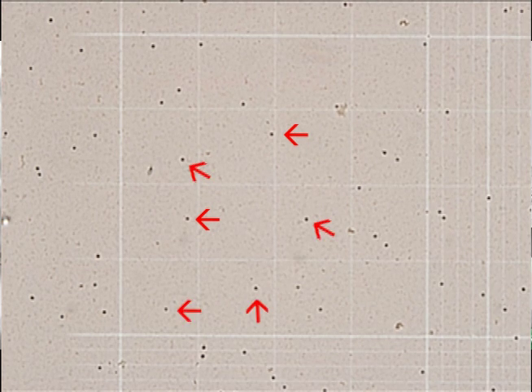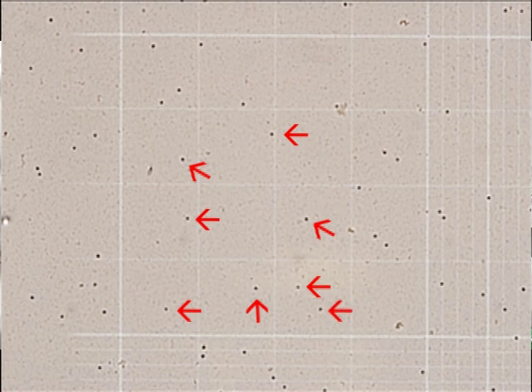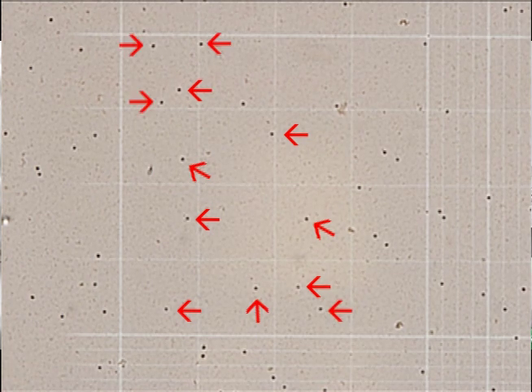After completing the count on each side of the hemocytometer, make sure to note your results on a lab report form. That concludes the demonstration of the manual white cell count.